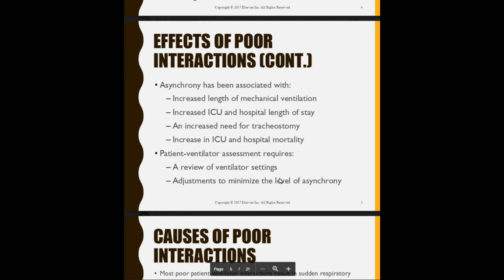Okay, let me say that again. When you have a patient who's on AC mode and they are breathing more than the set respiratory rate, meaning to say if you set it at 12 and they're breathing 24, 26, that means they're breathing 12 extra breaths, 13 extra breaths on their own. They got a good pull, they're able to trigger, and they're most likely able to get volumes. Once you see that, don't be afraid to switch them to SIMV, because if you don't, they're going to have an increased work of breathing because they might want to breathe, but the ventilator is not letting them breathe.